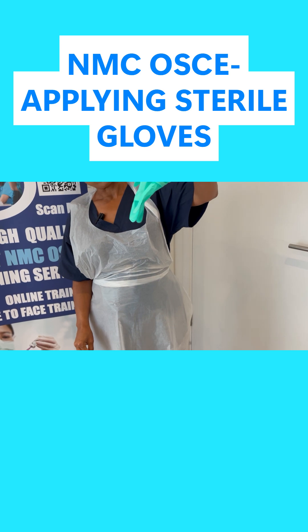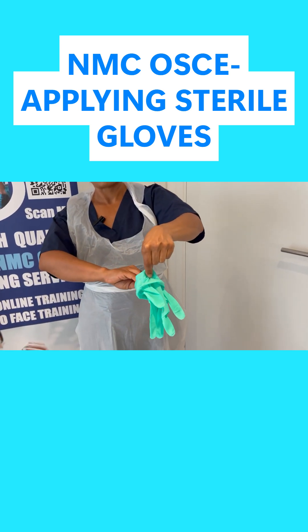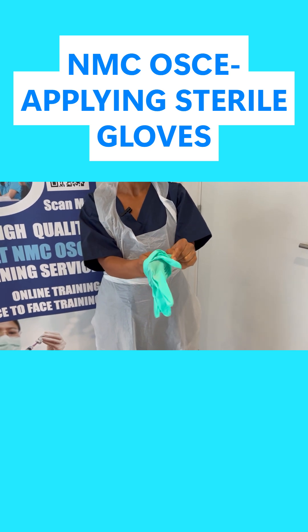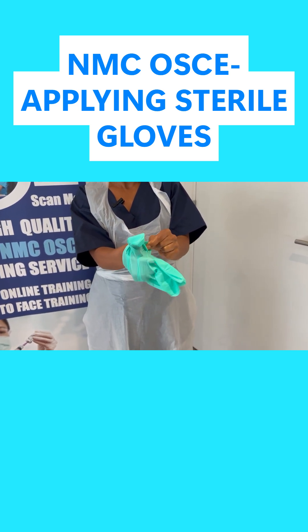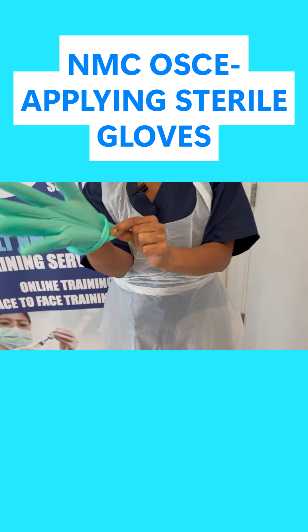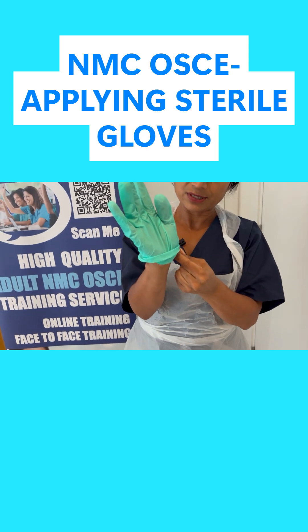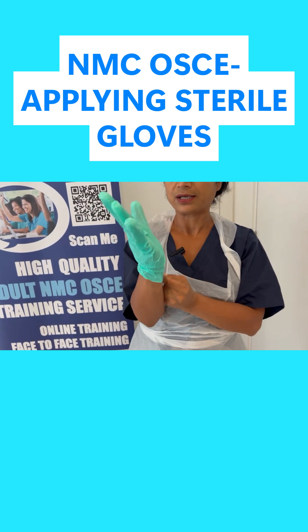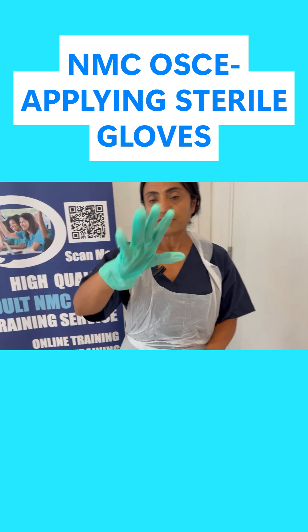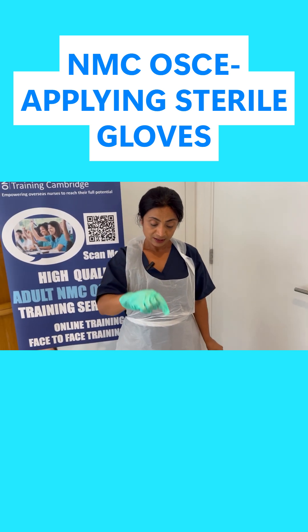I'm going to look carefully for where the thumb space is on the right-hand side. Then I'm going to put my hand in slowly — inside is fine because you're touching inside, it doesn't really matter. I'm putting that on. So I've not touched anywhere outside of the glove.